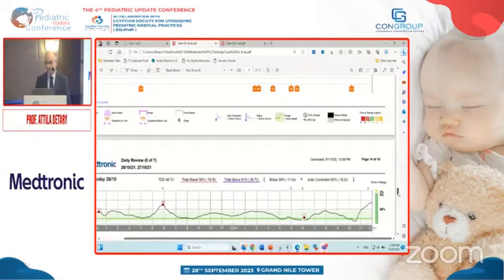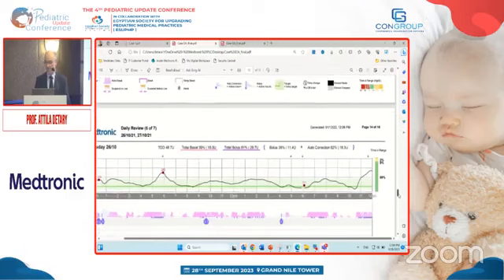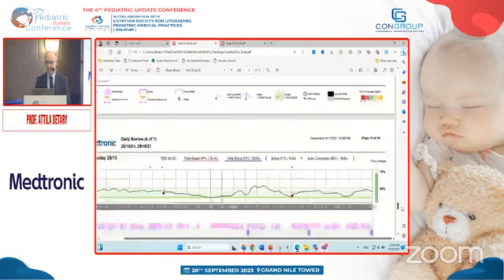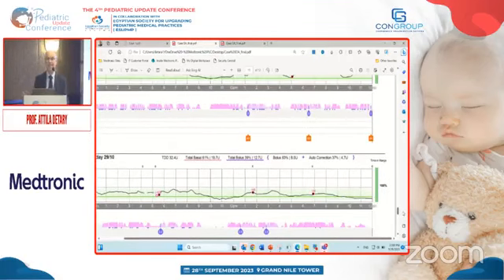But as I told you, the system is learning. 89, 80 again. And in the end, after 7 days, this patient achieved even 100. So this is why I brought this example, just to demonstrate to you that after the switch into the auto mode, an improvement will come. And this improvement can come very soon for some patients. For other patients, it can take some time because the algorithm learns.